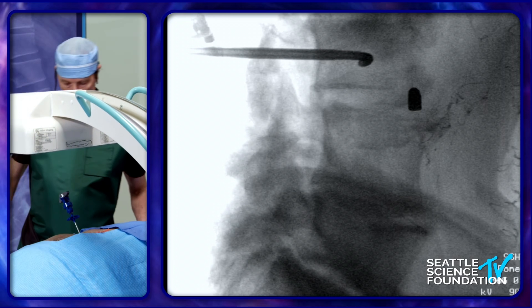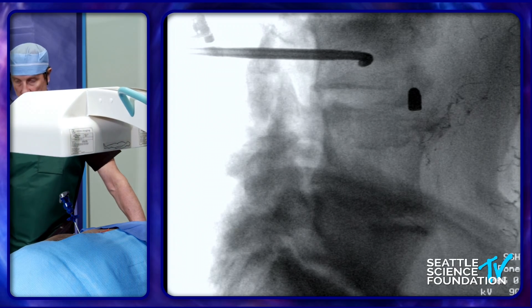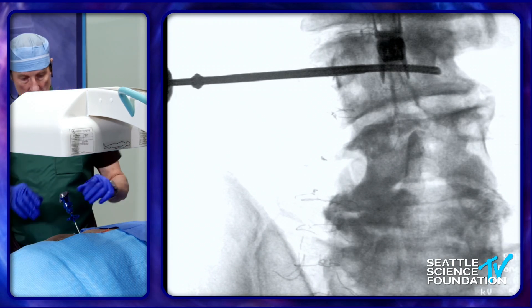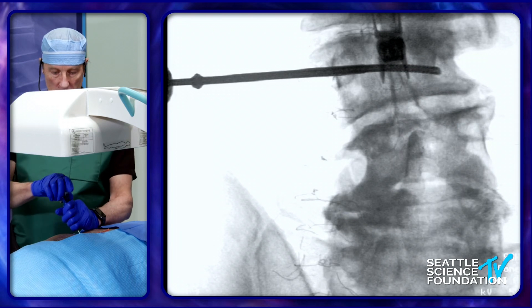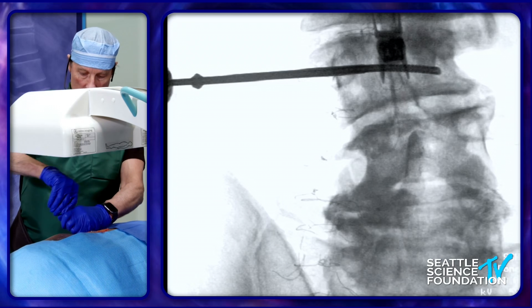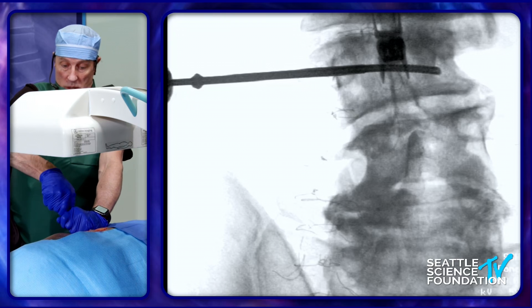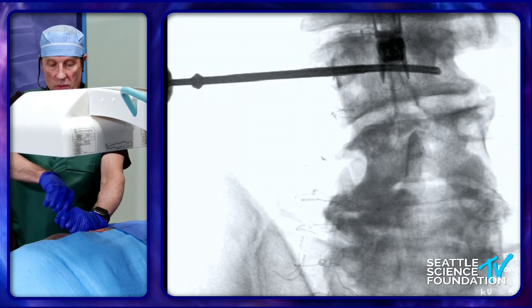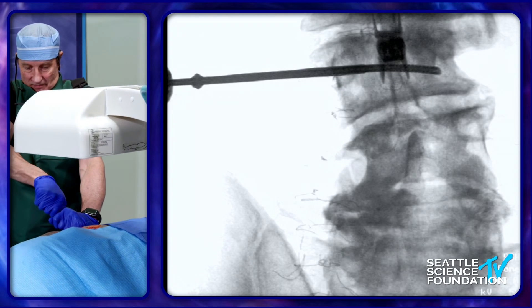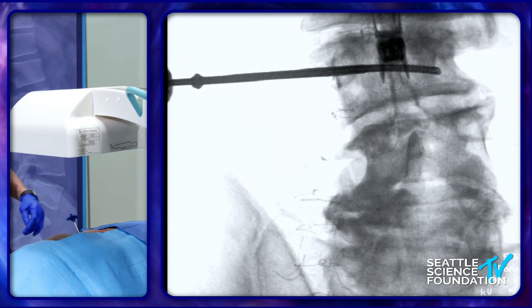I'm going to use the Arcadia balloon. We should be all the way across to the other side, at least. That's a very nice throw. I'm going to remove this — just a counterclockwise turn and take it out. This will demonstrate to you how hard this bone is.